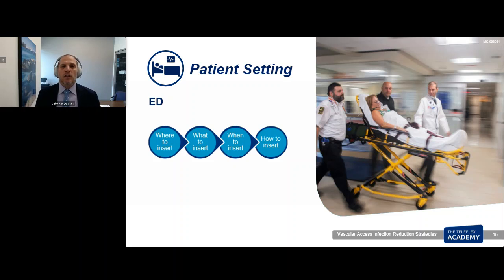When I am in the ICU and I receive somebody who has a central line that was placed in the femoral location, I think about why. So maybe it's because the patient is incredibly anticoagulated. Maybe the patient received TPA for a stroke, and then they became hemodynamically unstable, and so the central line needed to be placed in the femoral location. And that's absolutely acceptable. Just do it in a sterile and clean fashion.